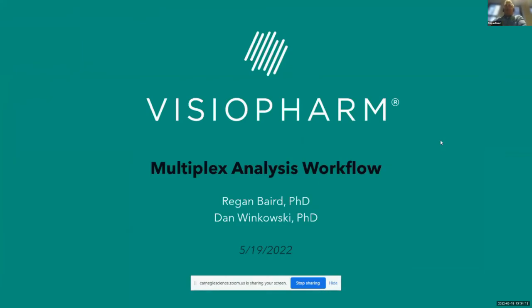And I'm going to, like most of my colleagues, focus a little bit more in the animal space, but hopefully I can relate a little bit of this to plants, thanks to Kirk. And I might show some of the images. I don't know if I have permission to show, Kirk, but they're in this presentation.